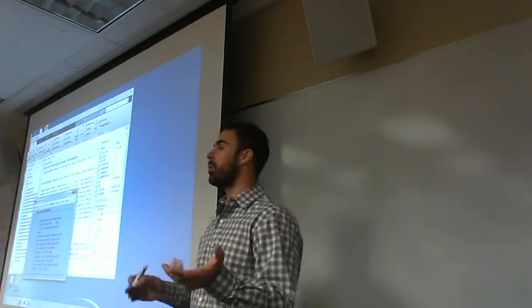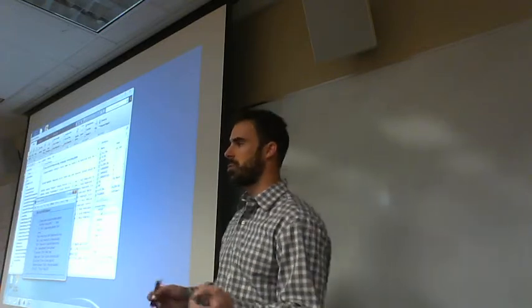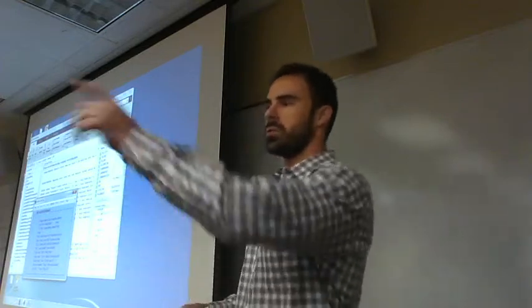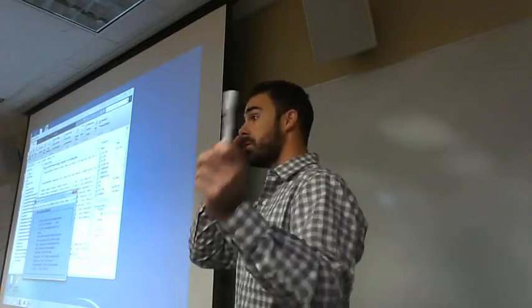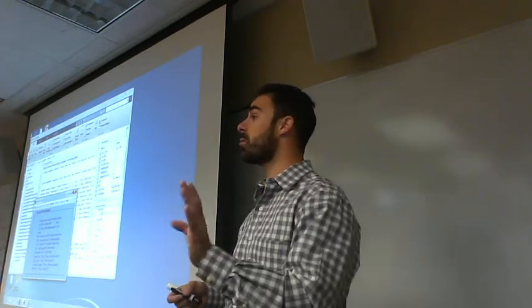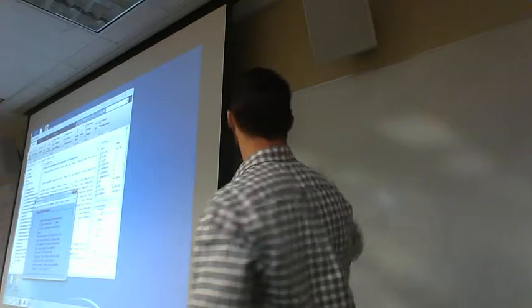Okay, so 33 and 34 are our reference channels. Remember we said that we're recording from 32 channels? Are you guys ready to go? Yes? Okay. So we have 32 channels. We also mentioned that we're using 33 and 34, and then we added even more. So there's actually 40 channels. Let's take a look at what they are, okay?